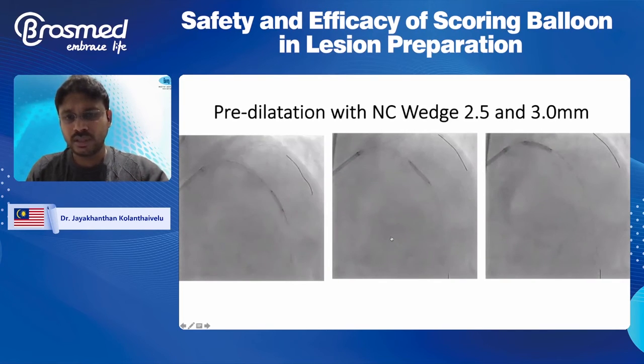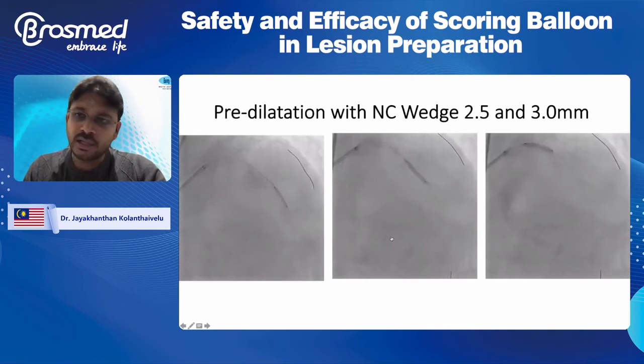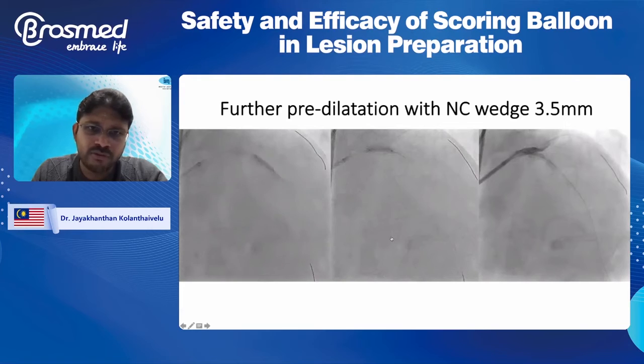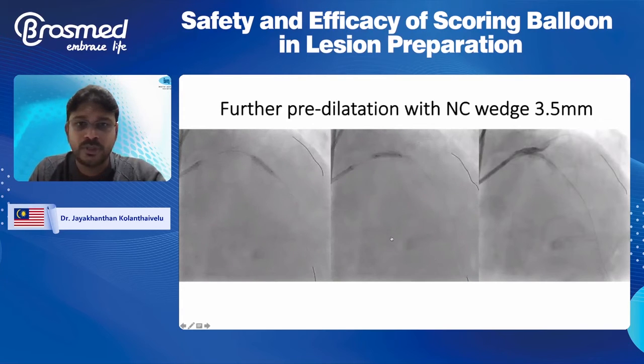And then we upgraded to a 3.0. You can see that at the left main to LAD proximally, there's still a little bit of dog boning. We're not very happy. This is after the 3.0. So then we went further, took a 3.5, went at very high pressures. The dog boning has actually somewhat disappeared.